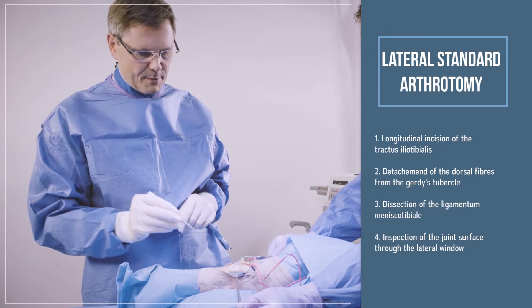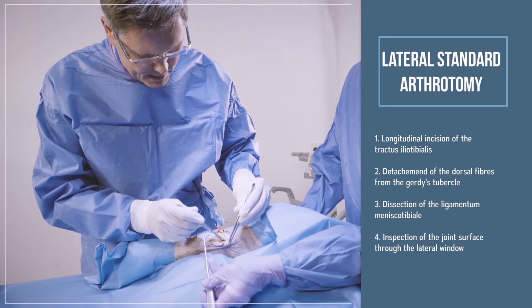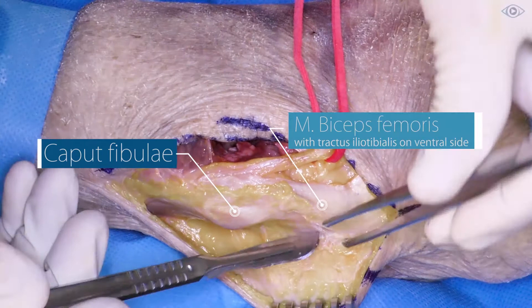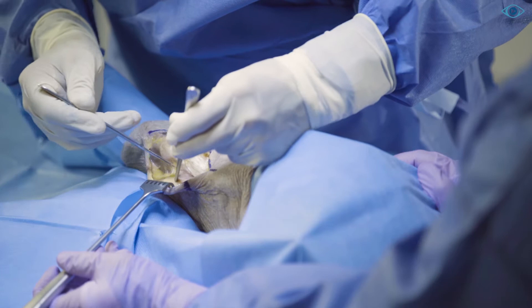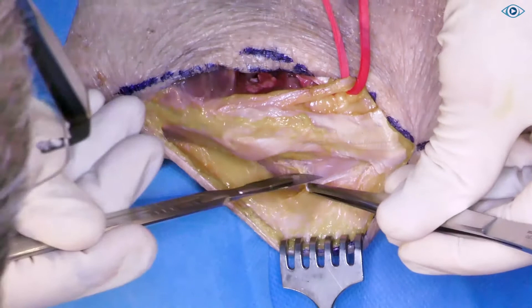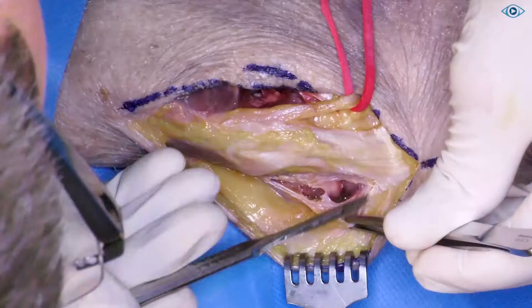Continuing in the prone position, we rotate the knee outward to reach the lateral plateau. Here on the side, we can nicely see the anatomy. The head of the fibula. Tractus iliotibialis is anteriorly to it. This is the biceps femoris, and here ventrally to the biceps femoris is the entry to the lateral plateau. Gerdy's tubercle would be underneath here. We can detach some fibers of the tractus longitudinally and get a first view inside, now from the lateral. This is the lateral window into the tibial plateau.